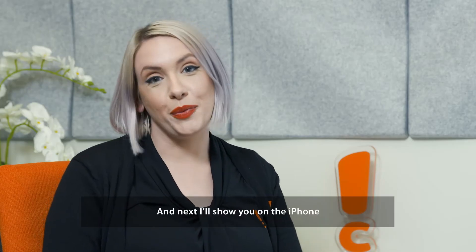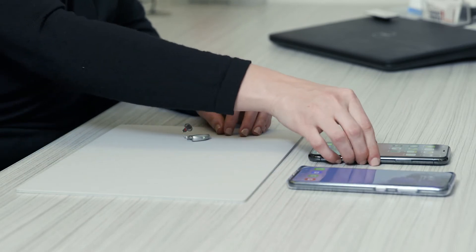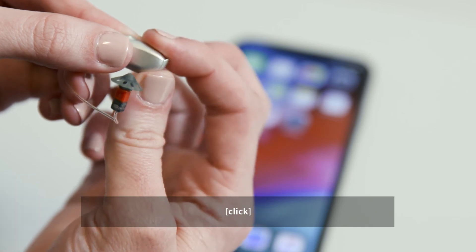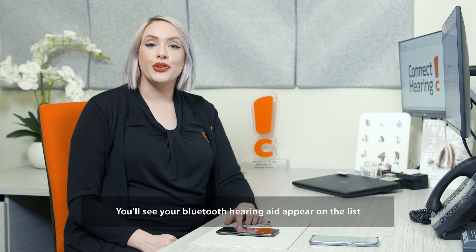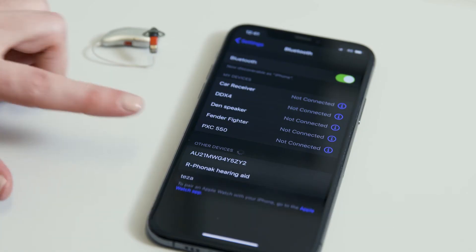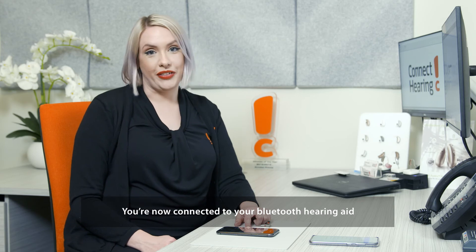Next I'll show you on the iPhone. Close the battery door on your hearing aid and open the Bluetooth settings on your iPhone. You'll see your Bluetooth hearing aid appear on the list. Select to connect. You're now connected to your Bluetooth hearing aid.